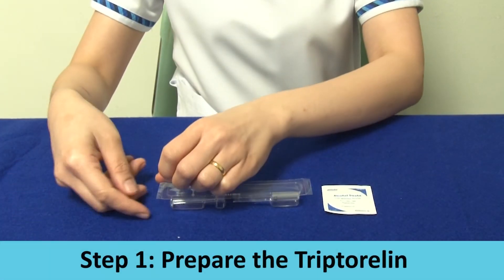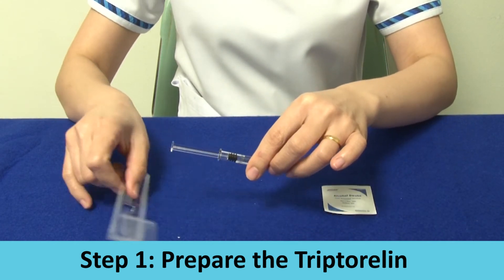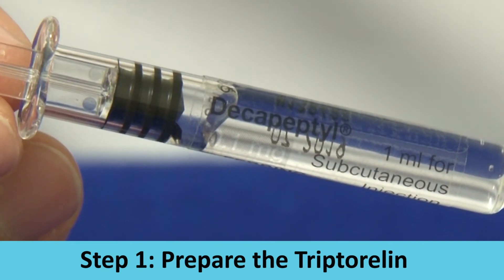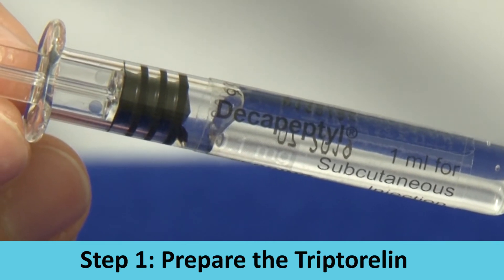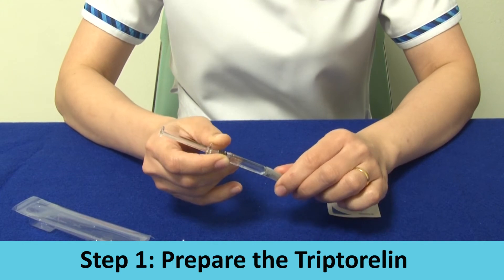Step 1: Prepare the tryptorelin injection. Inspect the medication — ensure it is clear with no particles and that it is not expired. Hold the syringe and give it a light shake. Remove the needle cap.